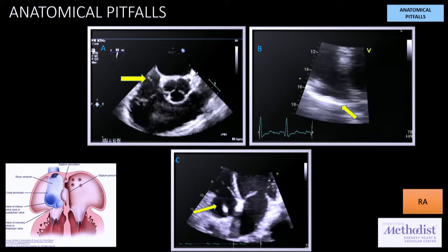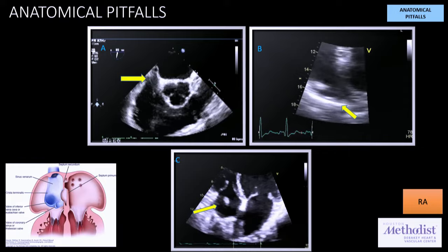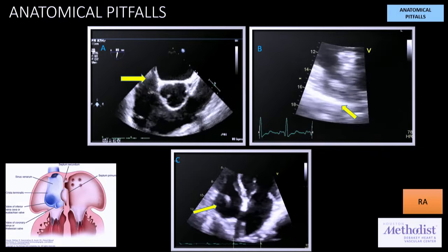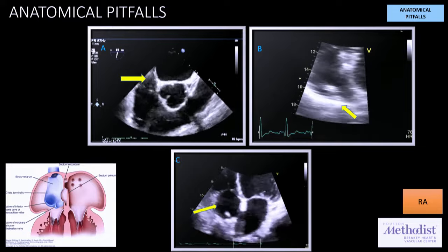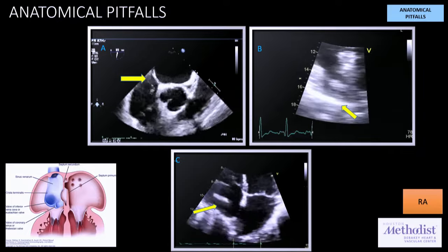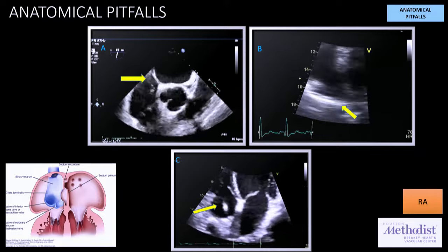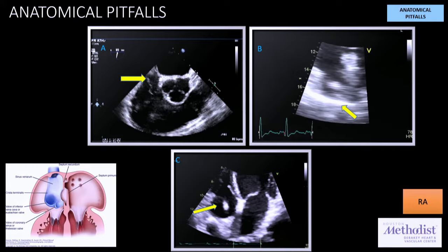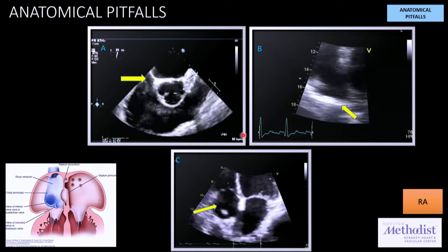Okay, I mean, that's pretty much the eustachian valve, right? This one is a crista terminalis. I think I heard that. Bindu, make sure you use the laser pointer. Prominent... the first is the eustachian valve, and the second one is the crista terminalis, as you mentioned, and the third one?